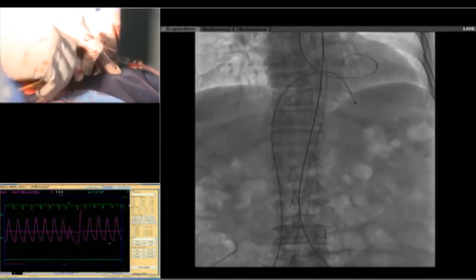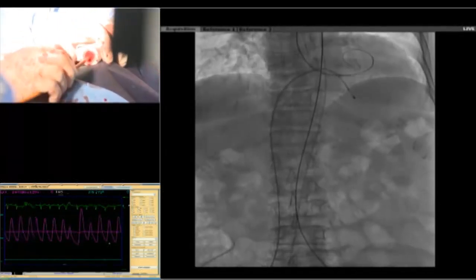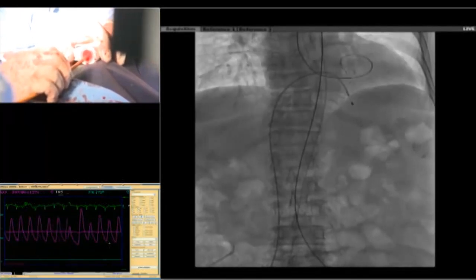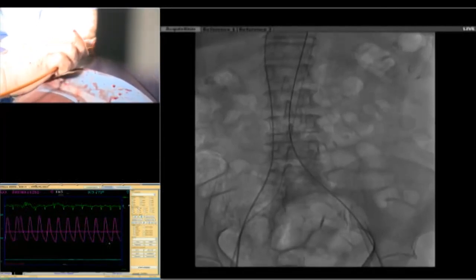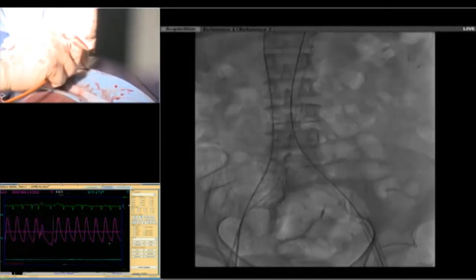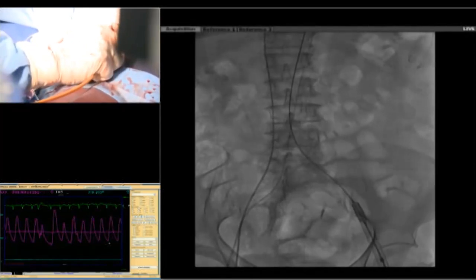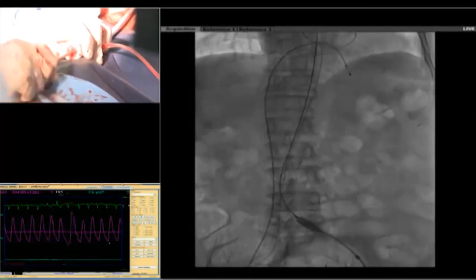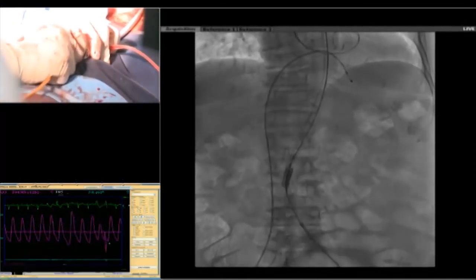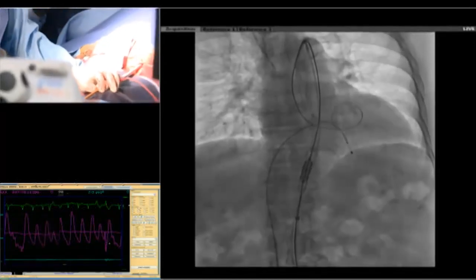But now you try to go in. That's good. So don't even lock it, just go. Let me see it now, down. Show us down. Okay. Can you push it? If you're not able to push it in, you can unlock it again. No, it's going. That's good. Okay, now show us the wire there, wire above. It's a bit tough there. Nice. Show us the wire in the LV. Good. Nice. Some resistance. A lot of resistance.